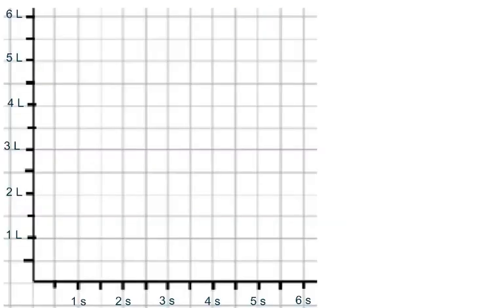Now let's plot FVC and FEV1 on a graph and compare the normal lung function with obstructive and restrictive lung disease pattern. On the x-axis we have time in seconds, and on the y-axis is the maximum volume of air expired. It is measured in liters. Normally, when the patient blows out forcefully after maximal inspiration, the curve looks like this.